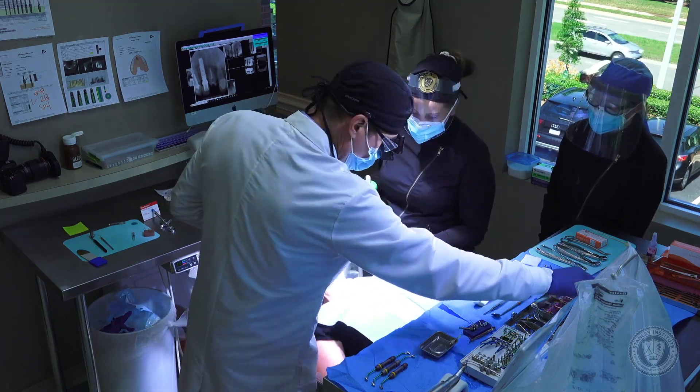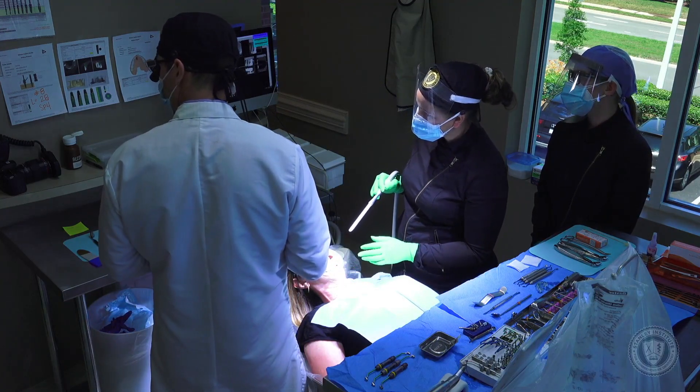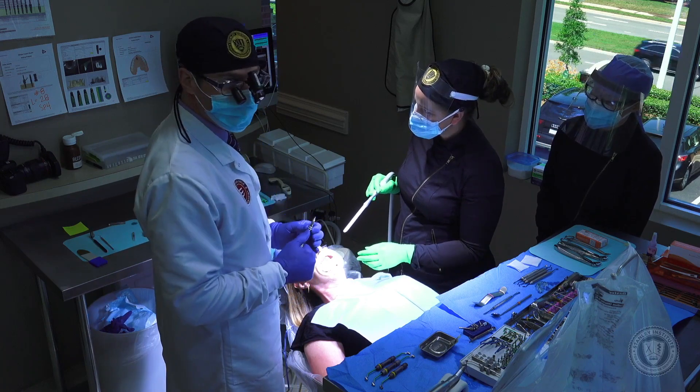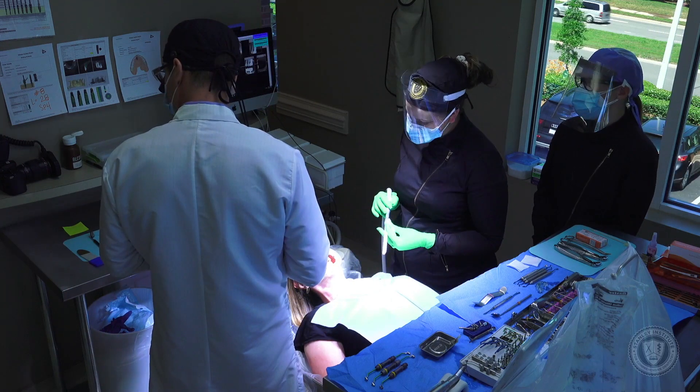Now the first thing I want to do is remove that crown, so we're going to put in a throat screen. We have a roaming camera today, so we'll be cutting to some of those shots as we go. We'll also be using some special instrumentation today that will help facilitate your viewing pleasure from home.